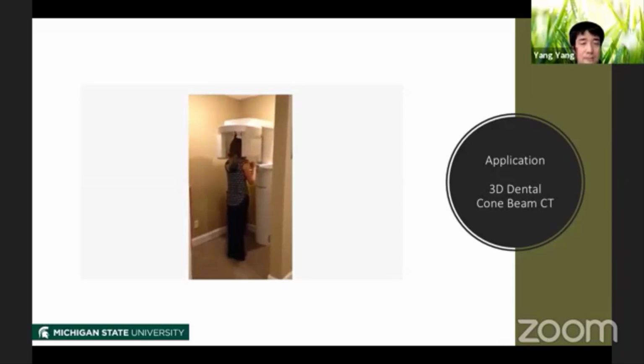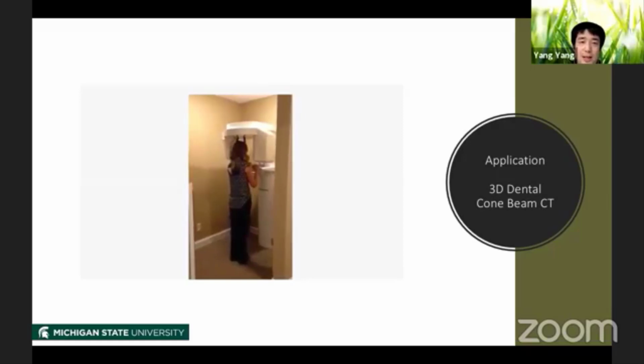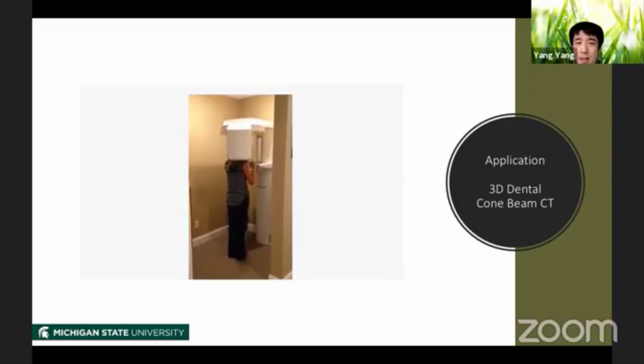Based on the last slide you have seen, we know that this rotation actually gives us the images, or the projections, the shadows from different angles. So what is really going on here is, in one of the handles there's the X-ray source, and in the other handle there's a photographic plate. Now this source projects through the human body from different angles, and the plate collects the X-ray data.